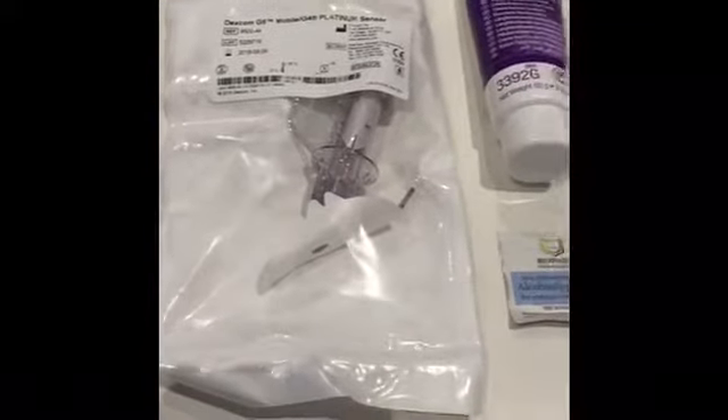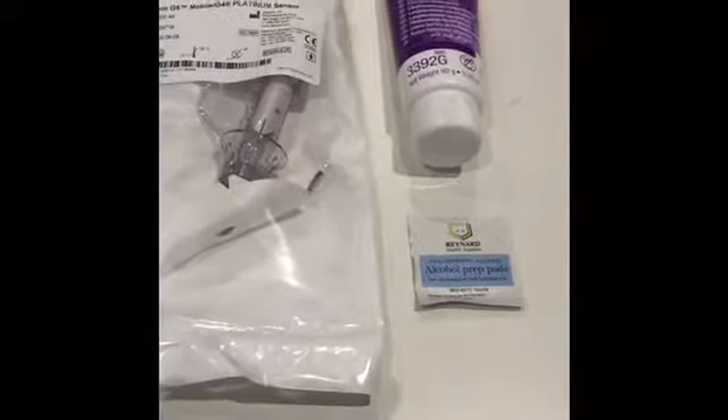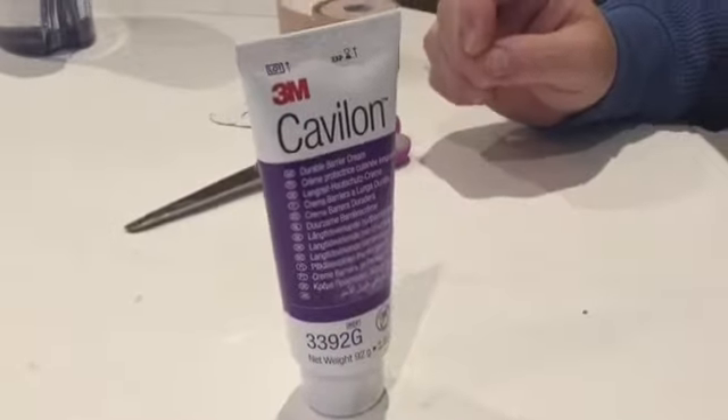To complete this change you will need a sensor, a sensor insertion, an alcohol prep pad, and optionally some cream. Start by using a prep pad to clean the skin. If you're choosing to use cream, apply it onto the skin and wait for it to dry.